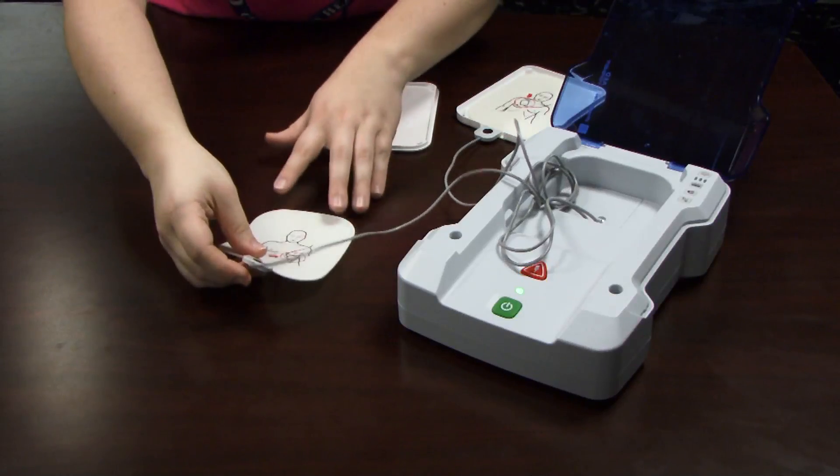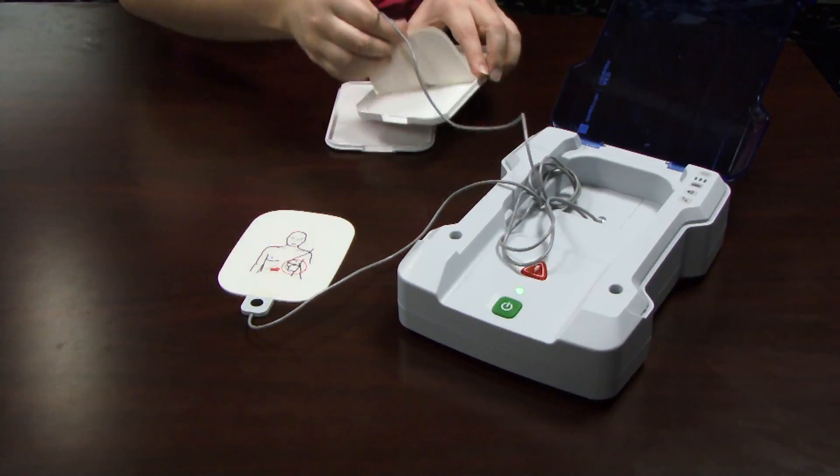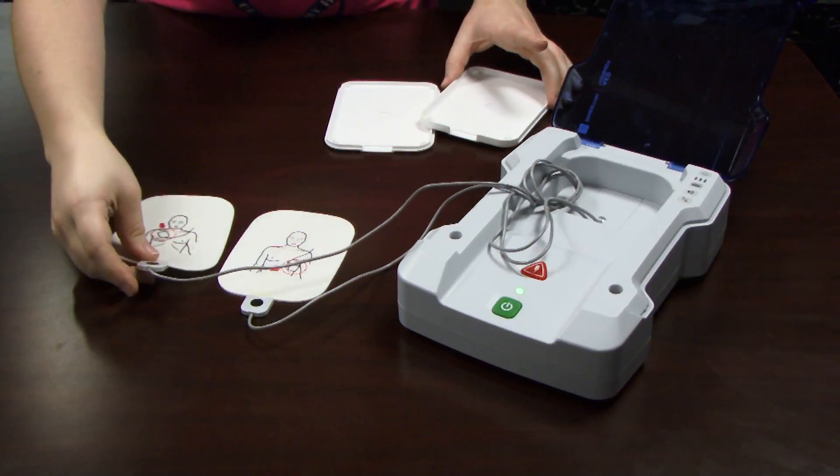Lightly press the pad switch and listen for the beep. Hear the beep? That means the pad is working. No beep? It's time to replace the pad.